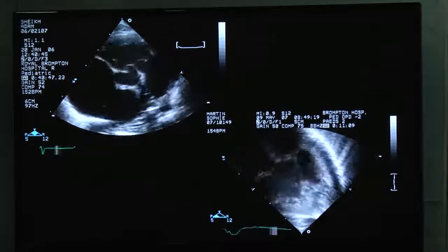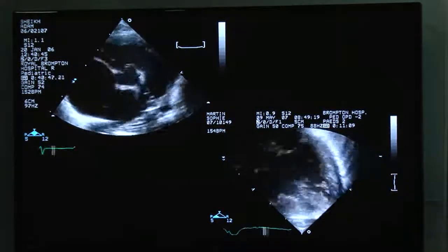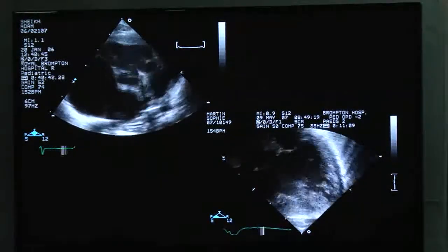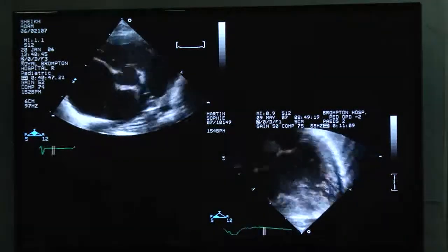And this is one typical where you have fibrous continuity between the aortic and the pulmonary valve. So this is a doubly committed subarterial VSD. So there is no possibility of a device closure here. And even otherwise, the surgeon needs to know it because they approach it differently.